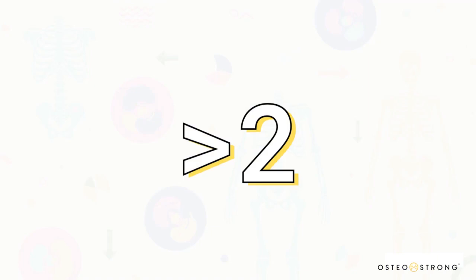And then there's major discordance. This is an even wider gap. We're talking more than 2 standard deviations. Imagine this. Your report says you have perfectly normal bones in one place, but osteoporosis in another. Now that is a huge red flag.